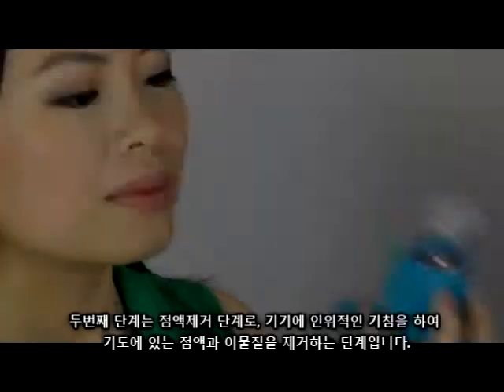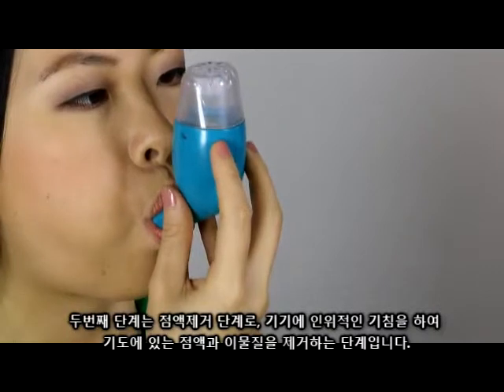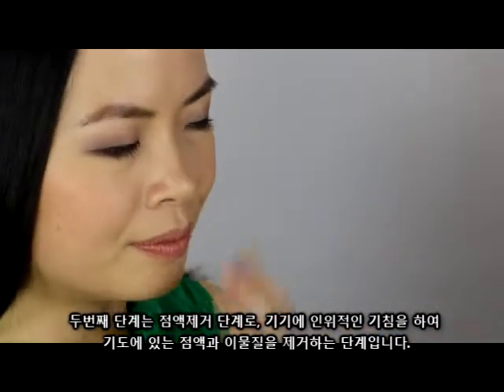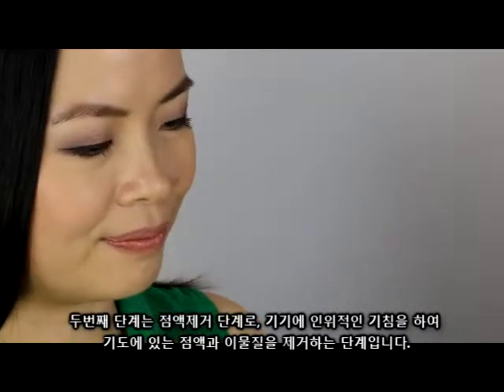The second stage is called the mucus elimination process, and assists in helping you to remove the mucus and materials from your airway by combining the device with induced coughing.